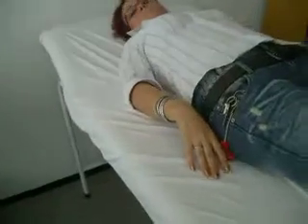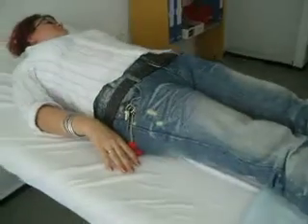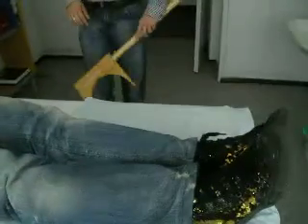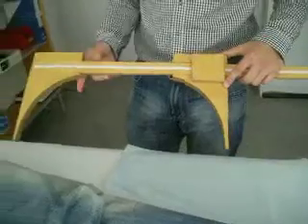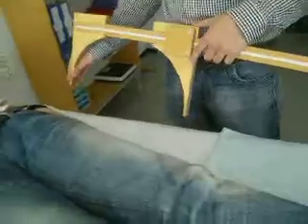Now one of the most important things is the jugulum-symphysis distance measurement, and I will show you how to measure it. For that, you can either use a standard tape measure, or it's better to have a so-called caliper. This is not the standard that we supply with the set. As standard, we just supply a simple tape measure.